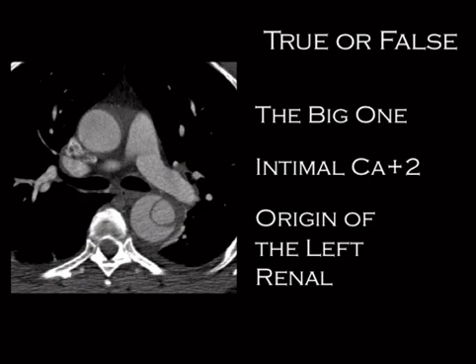So which one's true and which one's false? And what I mean by that is, which one's the true lumen, which one's the false lumen? So here are some general tips on that. The larger of the two is the false lumen. And the way to remember that is that it doesn't have the normal layers that the true lumen would have. So it's more flexible. It's going to distend more easily because it's not the normal coating that the artery has.